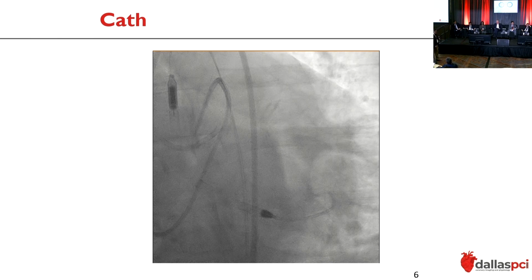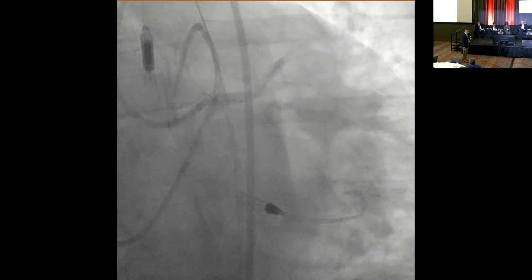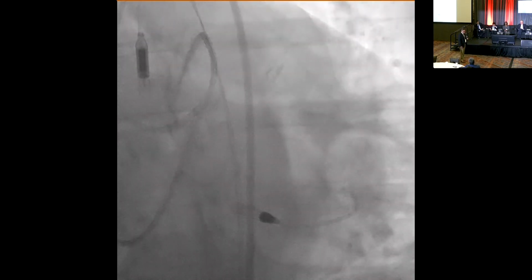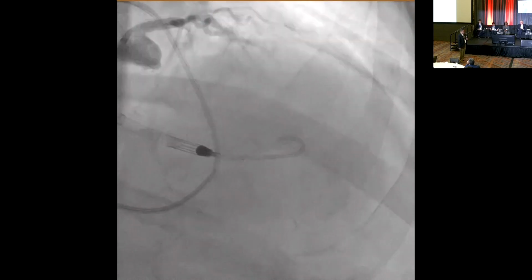So we said, I know the creatinine is 2.5. Why don't you take one picture of the left main to see how it looks, the LAD. Yeah. So he took a couple of pictures, probably 10 cc of contrast, which showed there is now good TIMI 3 flow in the LAD. Close to TIMI 3 flow. What do we do now?